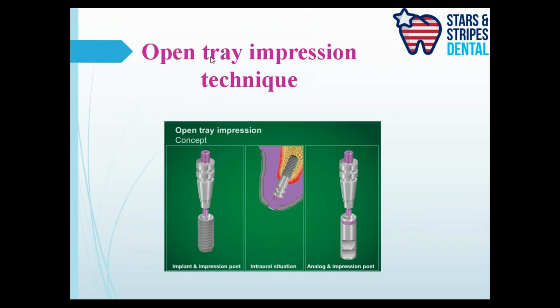So now let's talk about the open tray technique. Why is it called open tray? Because you are going to drill a hole through the impression tray, and you're going to retrieve the screw of the impression coping, and we'll learn as we go along.